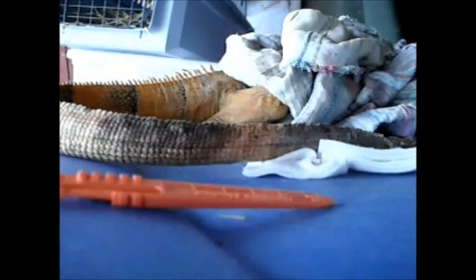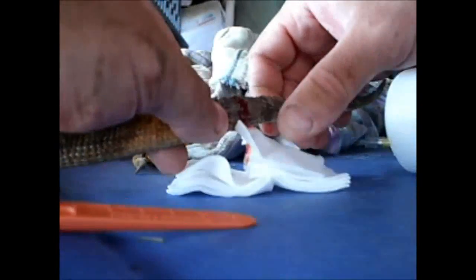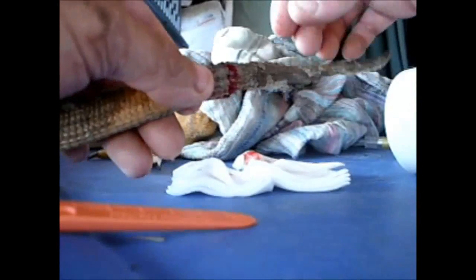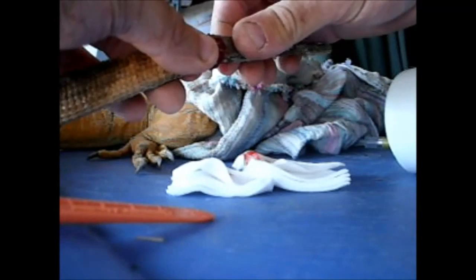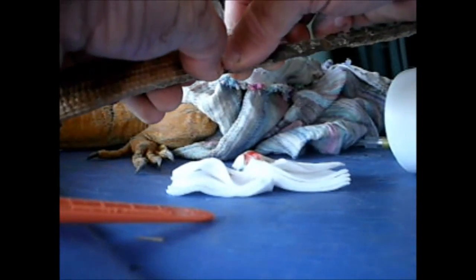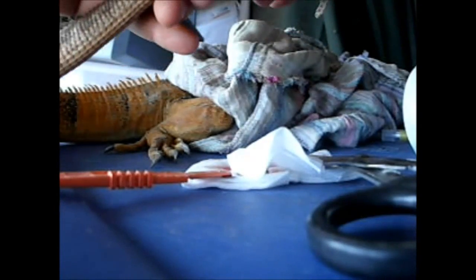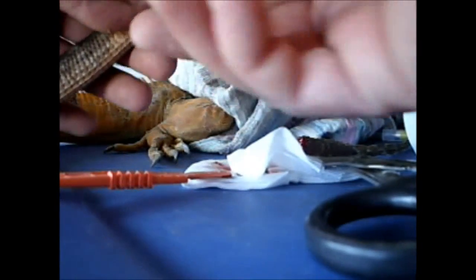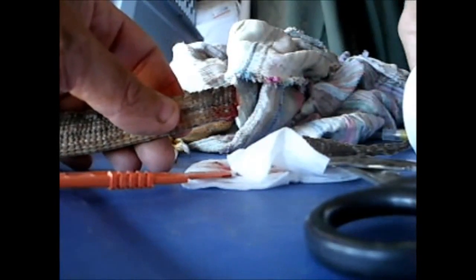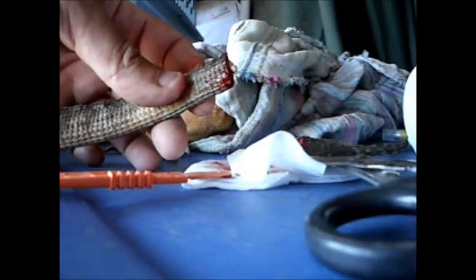And their tails have fracture planes. So pretty much what I'm going to try to do right now is, just after I've pretty much scored it with the scalpel, is to see if it will just snap. There we go. Got healthy tissue here.